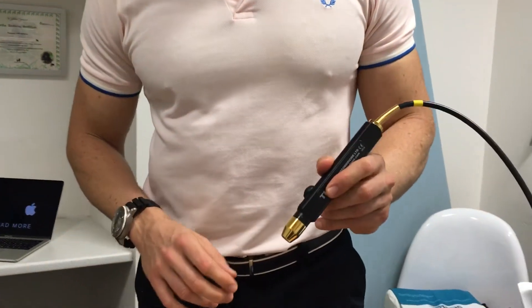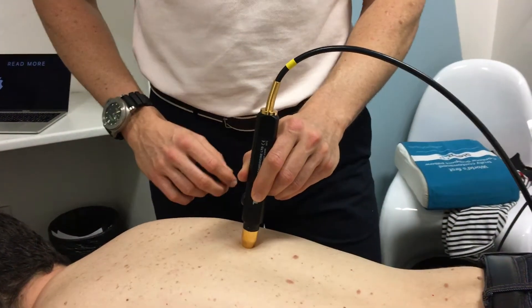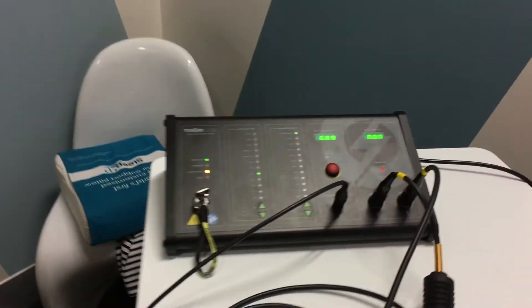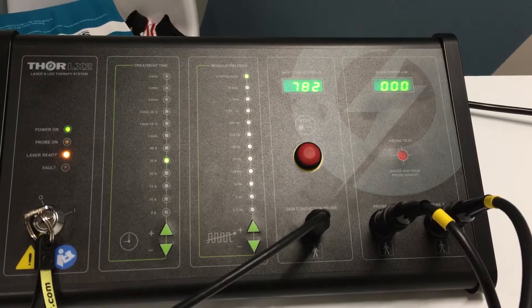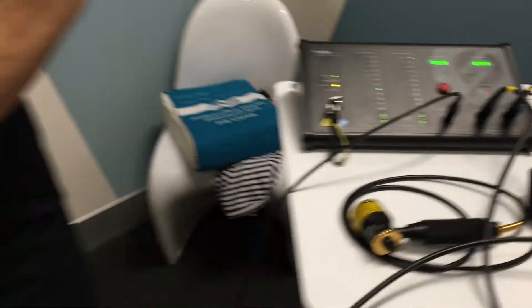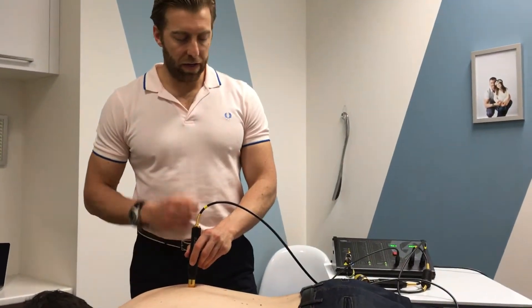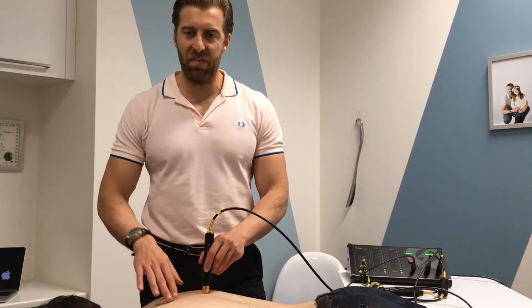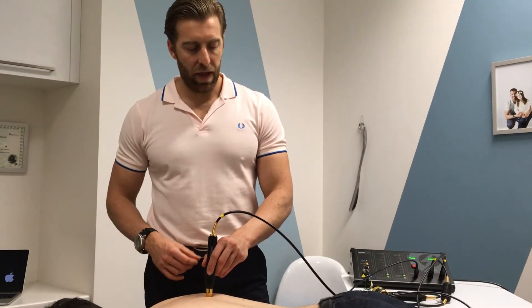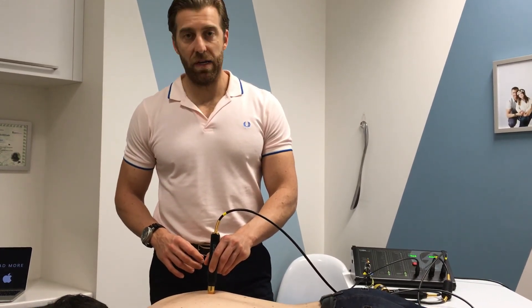If I want to go deeper still, I'll use the actual laser — as I place it against Lou's back you'll start to hear a sound which is a bit like an angry cricket. It's registering skin conduction, and basically the higher the number the more likelihood there is of a trigger point. I'll find the spot I like and treat away. I can locate the area by looking at the machine or simply by palpation, and this is a 30-second treatment per spot before I move to another area.